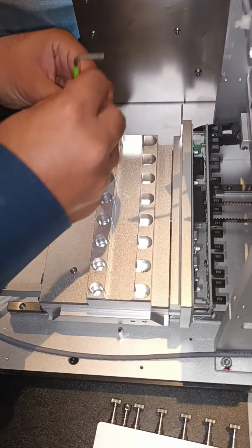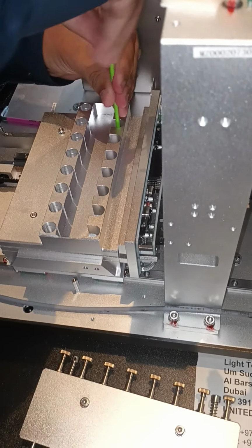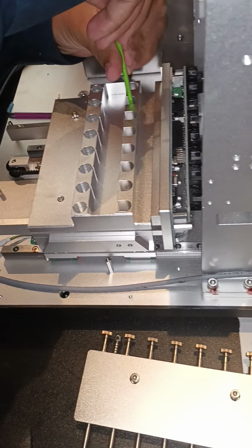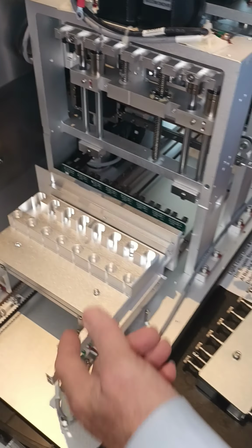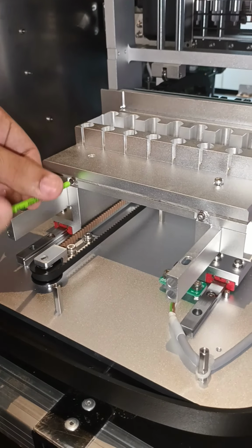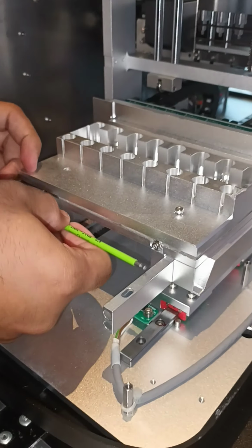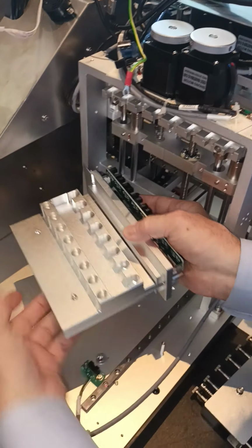Okay. Now we are taking off those 4 screws. To release this module, we need to unscrew these 2 screws. Now use this. Okay, and now we have to disconnect 2 screws in here.